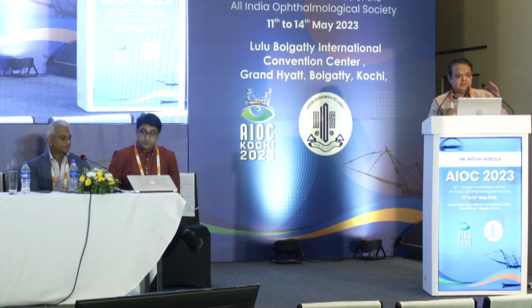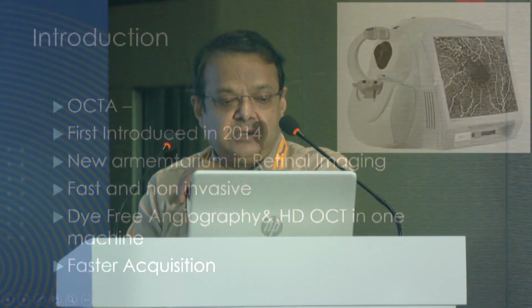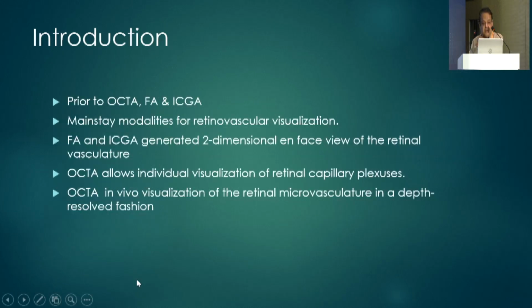With this, we'll move to the next talk, that is OCT interpretations and artifacts. OCTA was first introduced in 2014. It's a new armamentarium in retinal imaging, fast and non-invasive, dye-free angiography with faster acquisition.